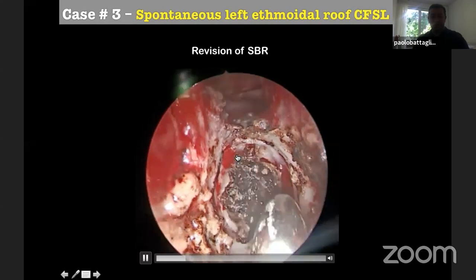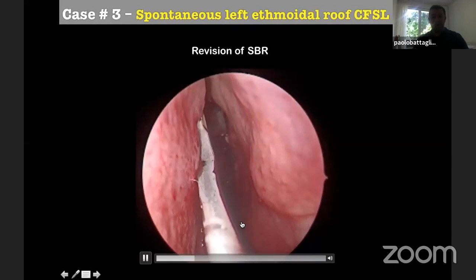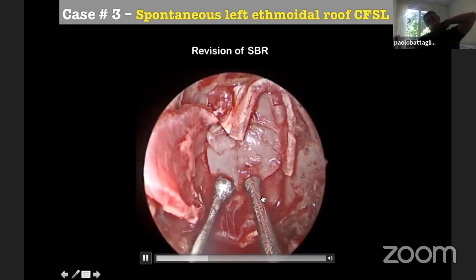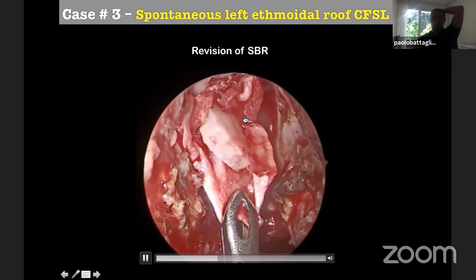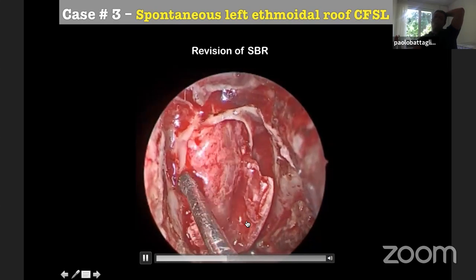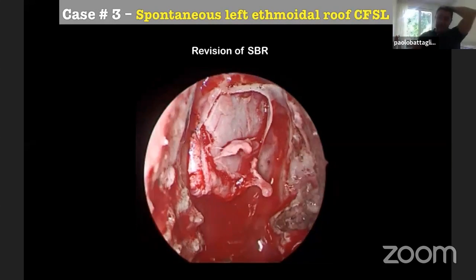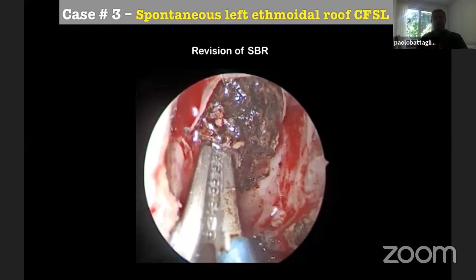This is the defect, quite a big defect of the anterior skull base. So as usual, with Castelnuovo, we try to reduce the mass, to smooth all the edges and to identify the origin of the meningoencephalocele. Then we tried here to make a gasket seal. You see, we put some fascia, and then with cartilage or bone, we tried once, but it did not work so well. So again, we took away the cartilage, we put the fascia towards the brain and tried to reinforce with this gasket seal technique, but it was not so good.